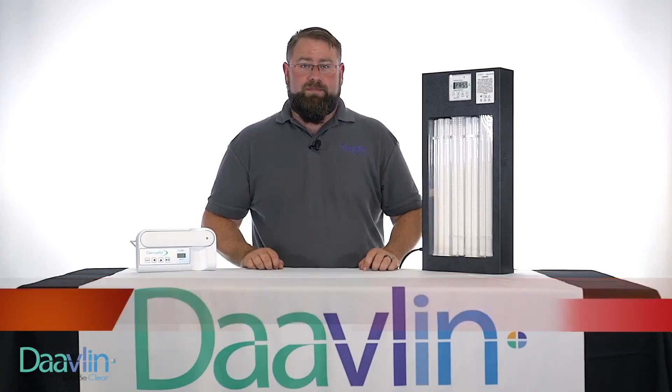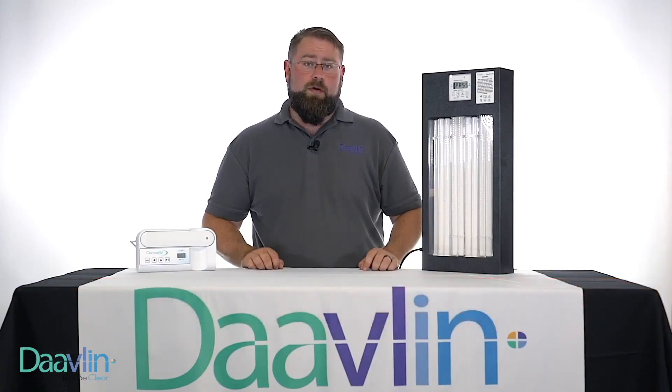Hello, I'm Justin Watson with the Davlin Technical Service Team. In this demonstration, I'll be showing you how to properly enter the pass number for your Davlin FlexRx unit.